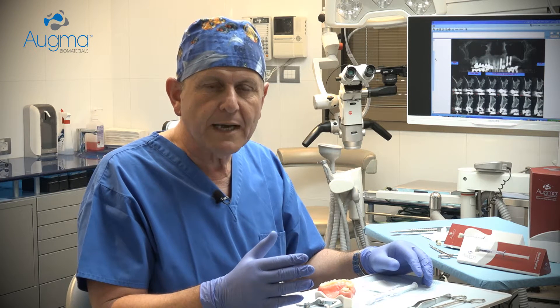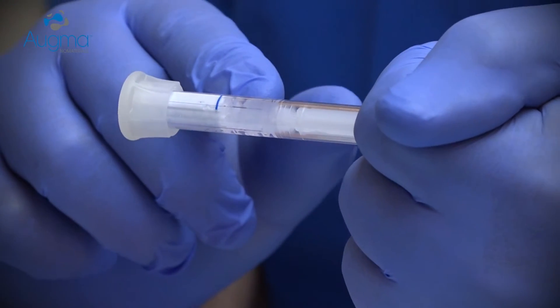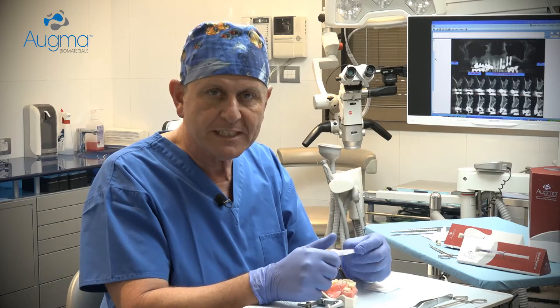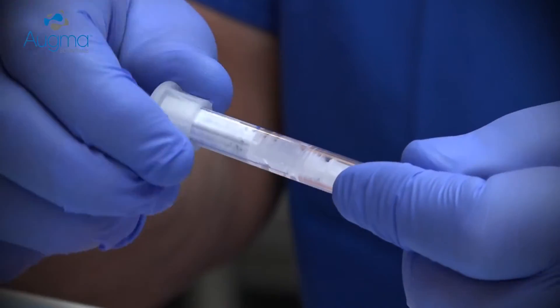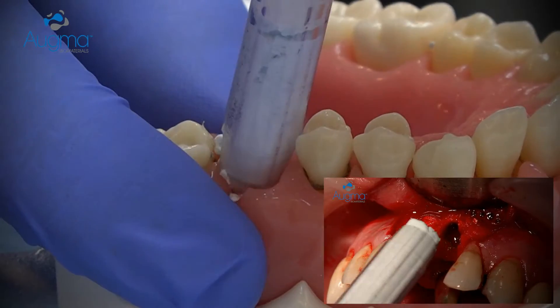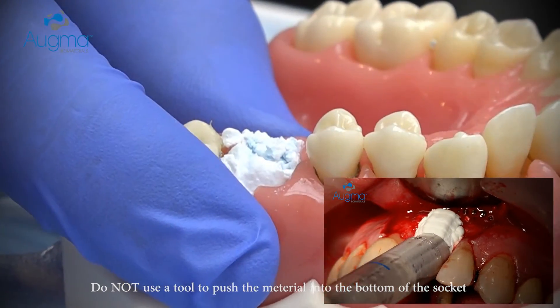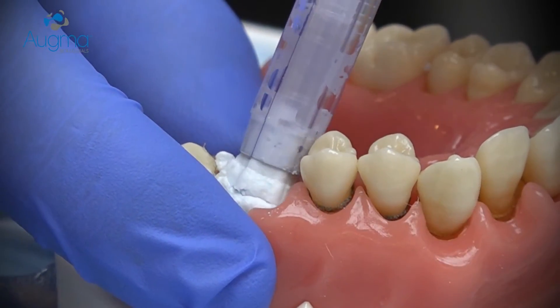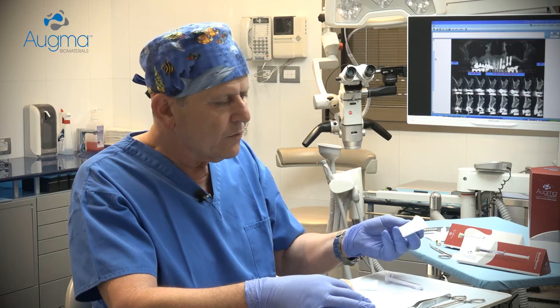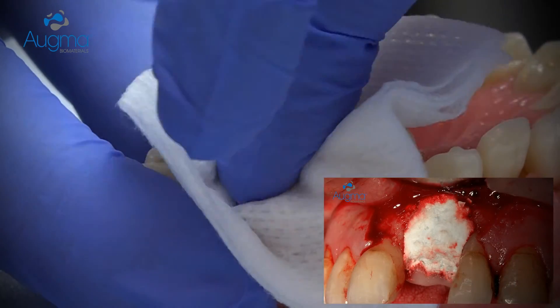Now I would like to demonstrate how to work with Bond Appetite for socket preservation technique when you don't reflect the flap. Press the shaft against the palm of your hand until the first piston reaches the blue line — the material is now activated. Remove the syringe head, approach the socket site, and eject the material into the socket. Slightly overfill it, then take a dry gauze and press the material firmly into the socket.